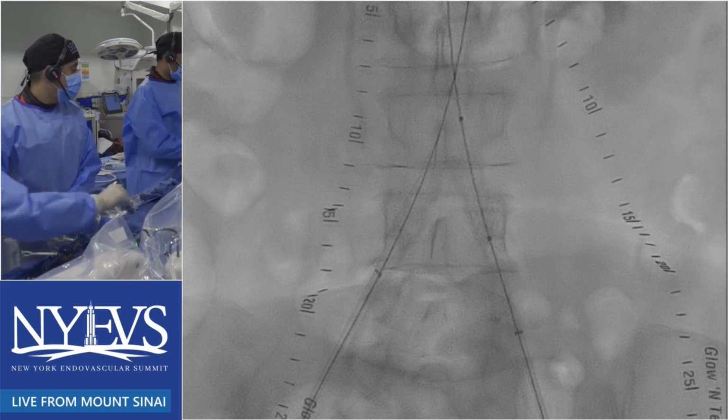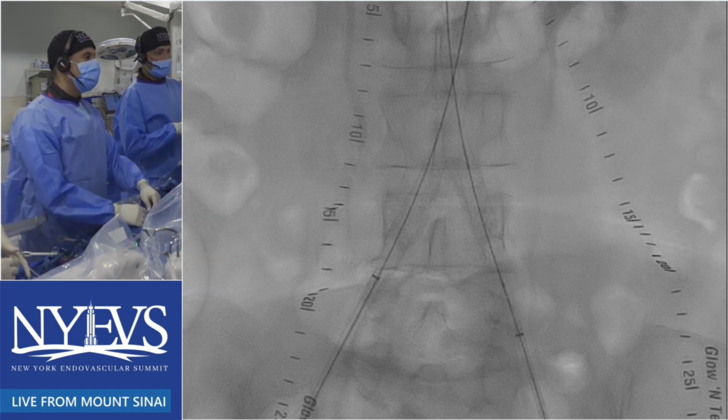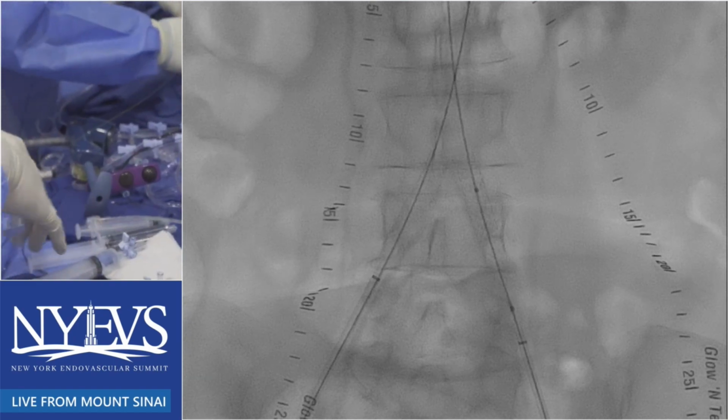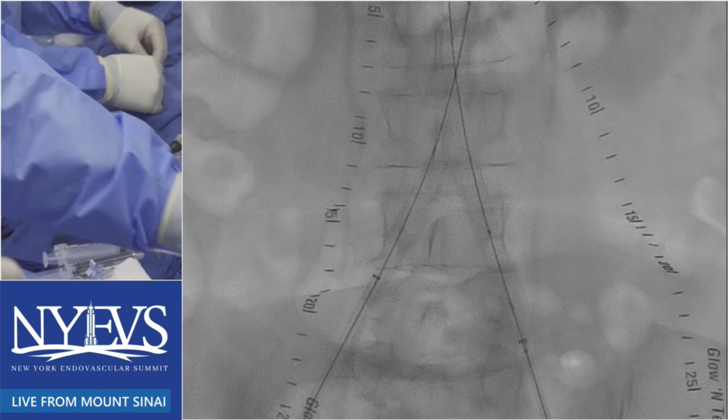So, Karthik, yeah, we went to 16 and 16, we went up into the aorta a little bit. And so you basically use the stent balloons themselves. I'm going to take a quick picture. We're going to take a quick picture and see.